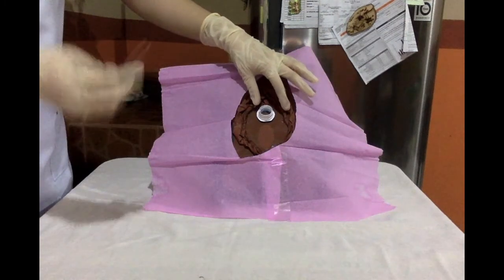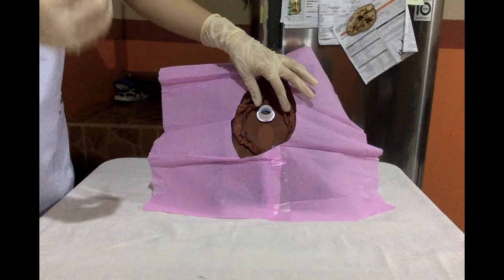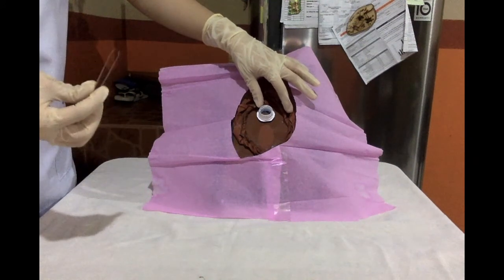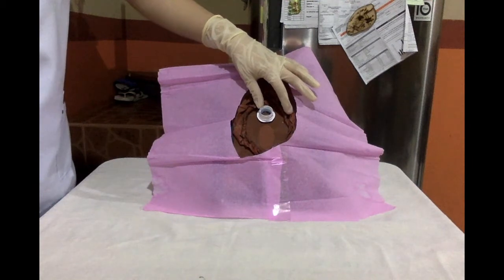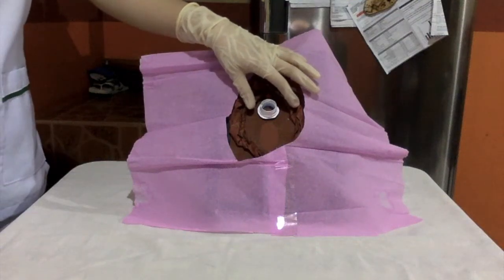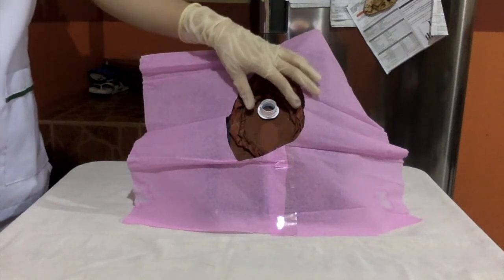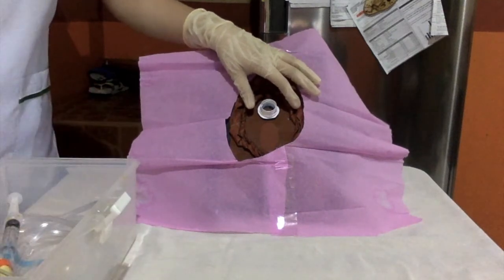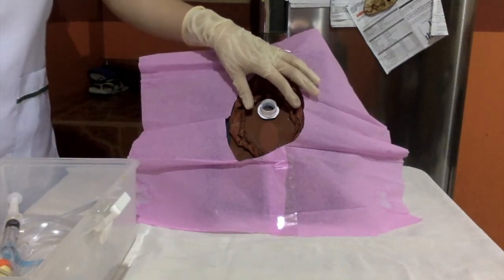After all the cotton balls have been used, I will now discard the forceps to prevent contamination of the sterile field. I will now move the cleaning tray, which contains the urinary catheter and the drainage bag, closer to the client. And now we are ready to insert the Foley catheter.